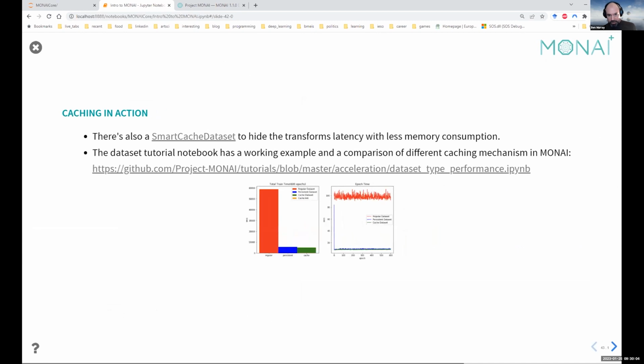The notebook is organized as a slideshow through the use of Rise, which is a nice library that you can pip install if you're using Jupyter Notebook.